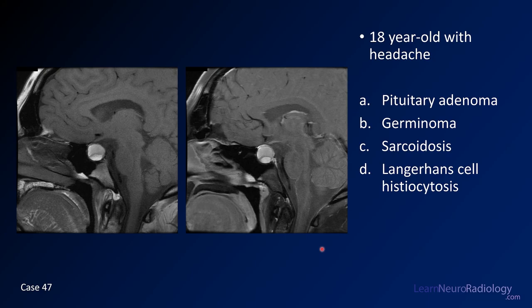Case number 47 is an 18-year-old presenting with headache. Two images — pre and post-contrast. It's key to recognize that the first image is pre-contrast. The choices are pituitary adenoma, germinoma, sarcoid, or Langerhans cell histiocytosis (LCH).